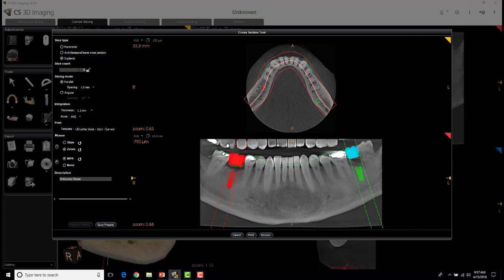On the left-hand side you can see the number of slices and the spacing — one millimeter spacing — and then the integration, which is the thickness. That's basically how thick or thin each of the slices are that you're actually looking at. This is the intervals and this is how they're actually viewed.